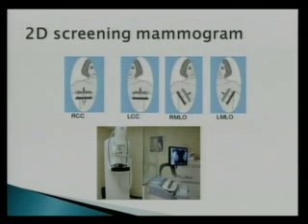For craniocaudal, it's talking about the angle of the beam. So you're going craniocaudal, they're put into compression, and they take that image, and then they reposition the x-ray tube, and then they take a medial lateral oblique view. So they'll do all 4 of those images, look at the images, and decide do they need to do more or not before they end the exam.